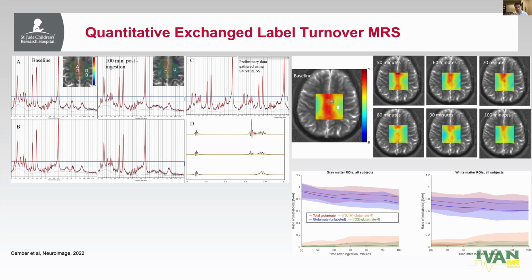So this is basically a glutamate spectrum when it's completely unlabeled, but then there could be a chance that one of the protons will also be labeled. So this is how the glutamate 4 peak would look, and see how the coupling pattern between the 4th and 3rd carbon is changing, and the 2nd carbon is unaffected because there's J coupling between the 3rd and 4th carbon. And also when you have both the protons labeled, again, the J coupling changes the proton spectrum signal.